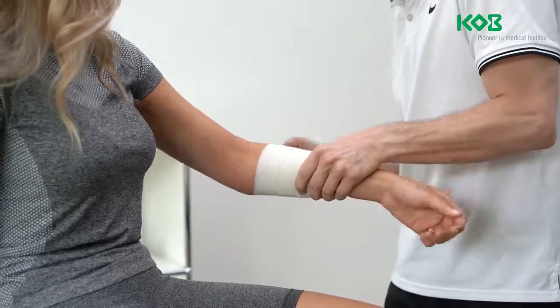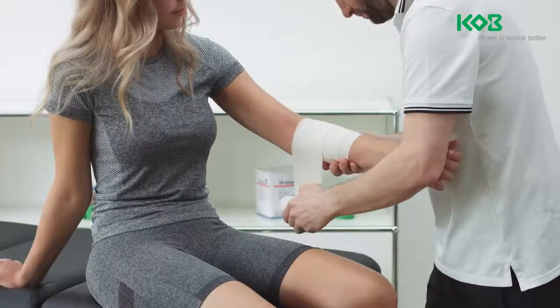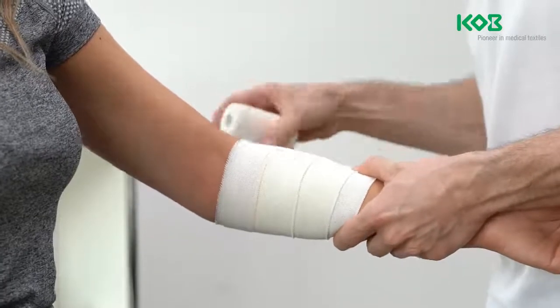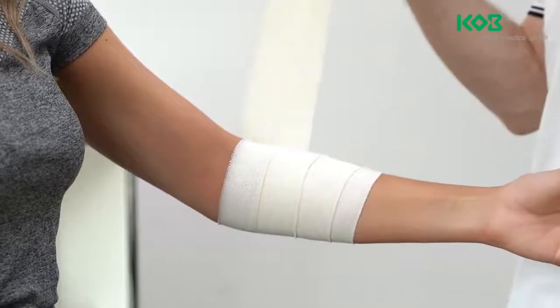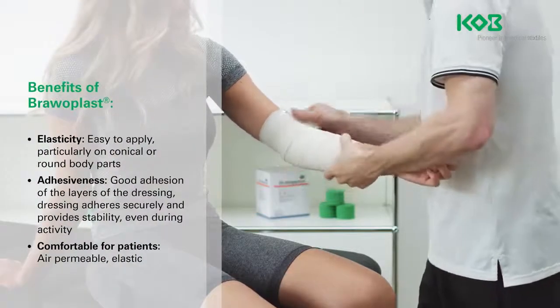Always unroll adhesive bandages a little bit before applying to make sure that the dressing is not applied with too much tension and is not too tight. Use the colored centerline as an application aid to ensure that the layers overlap by half the width of each layer.